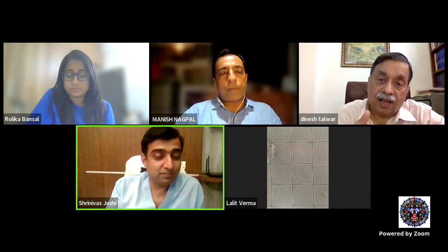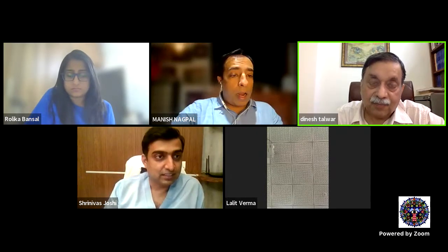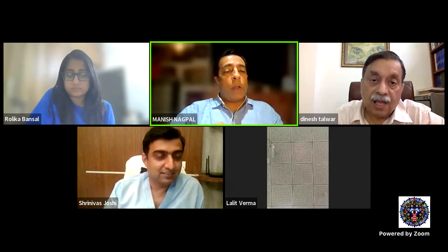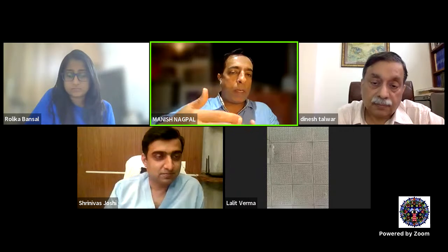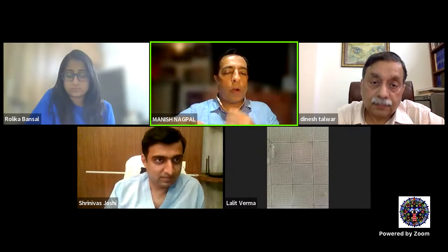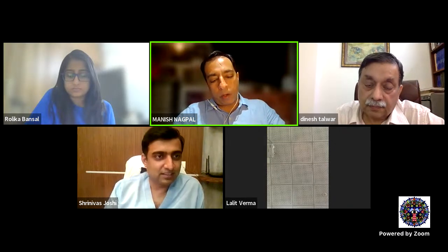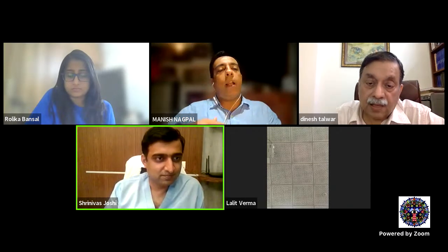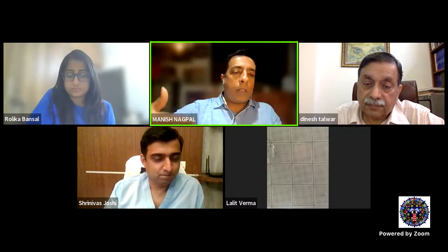But in case of even detached retina, Shrinivas, I do it under PFCL. I would not do it in a detached retina, because there I agree, if you give pressure, you might just create a break there. It will not, because there's a tenting. So whatever I showed you was under the PFCL. PFCL has its own weight, and then you are using an instrument to just iron out.